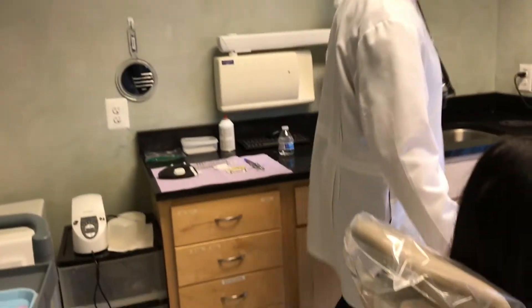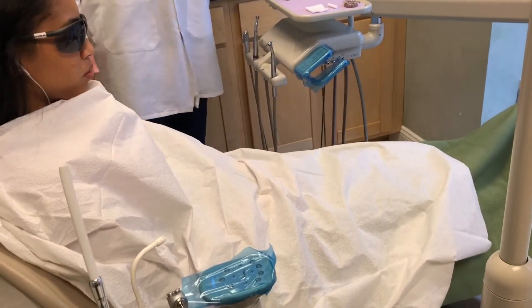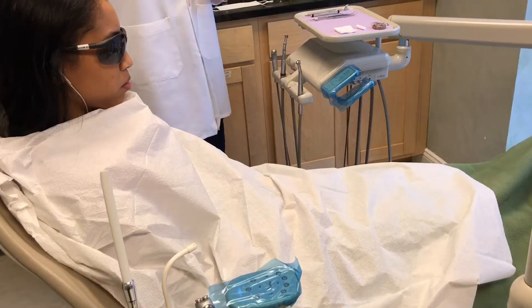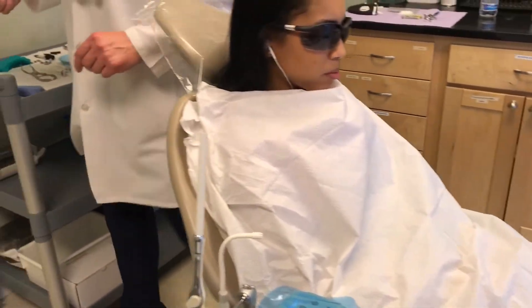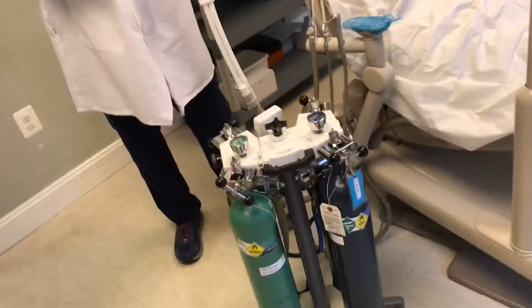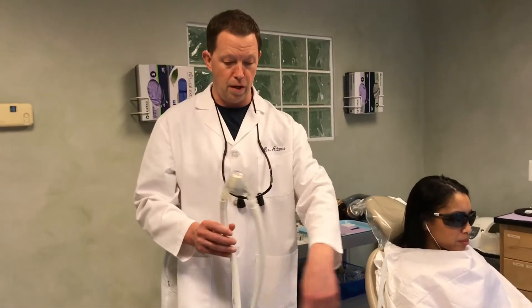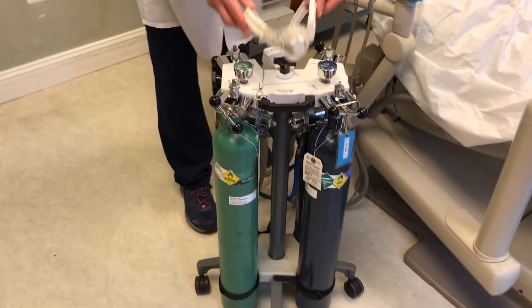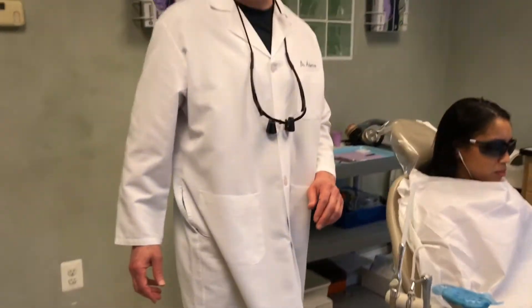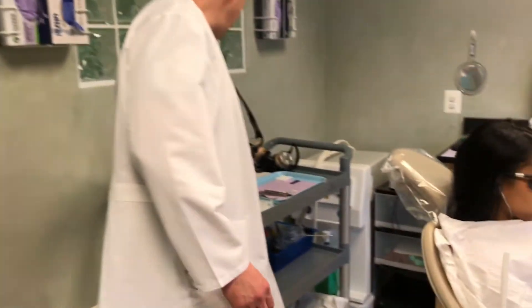Now let's talk about our basic setup to protect ourselves and the patient. All this material is thrown away when we're done with the procedure. We have a full barrier for the patient — they wear glasses to protect their eyes, and then we have an oxygen source that goes over top of the patient's nose so they get fresh, pure oxygen. We also have nitrous oxide, which is very helpful to keep patients comfortable while taking the amalgam fillings out, so they're focused on healing and not fighting our procedure.